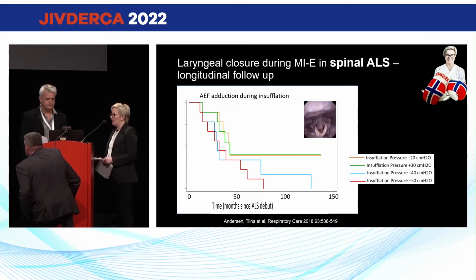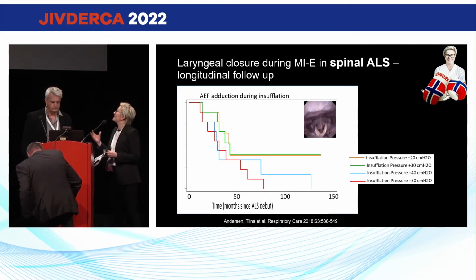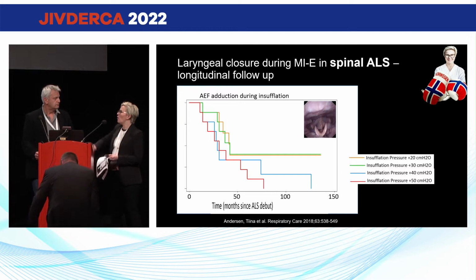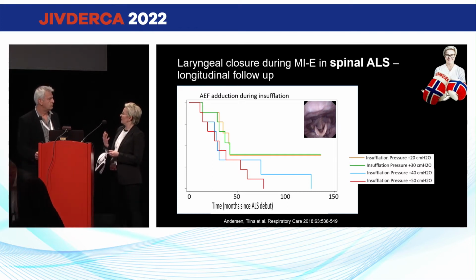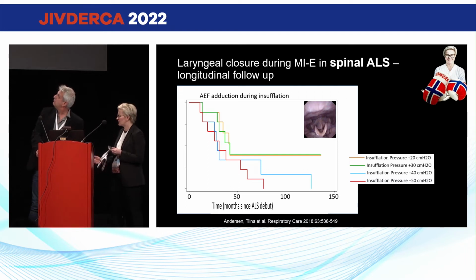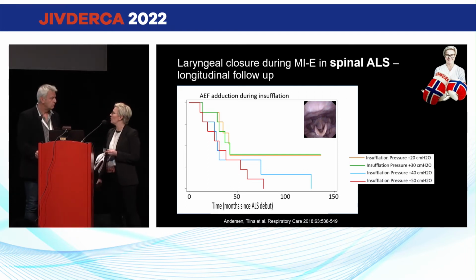Anyway, we also see that there are adverse events in the larynx in healthy persons. The positive pressures will blow the epiglottis in a retroflex movement, and we also see that healthy persons get that hypopharyngeal constriction during exsufflation, as Sancho showed a few years ago.